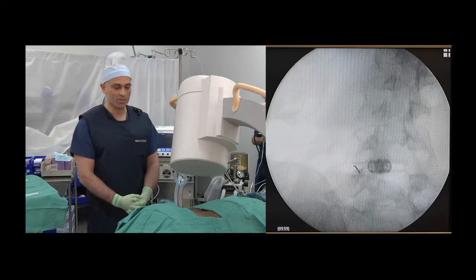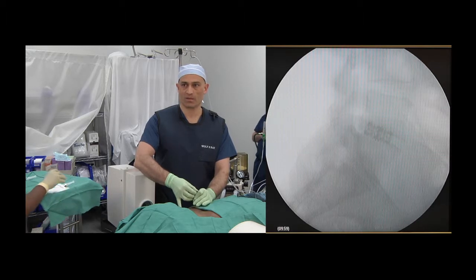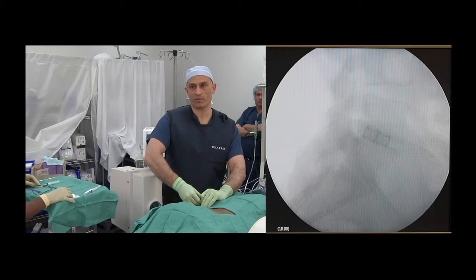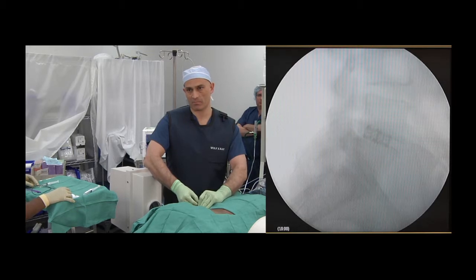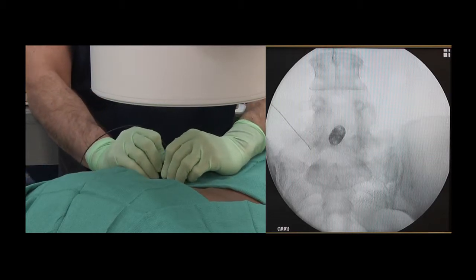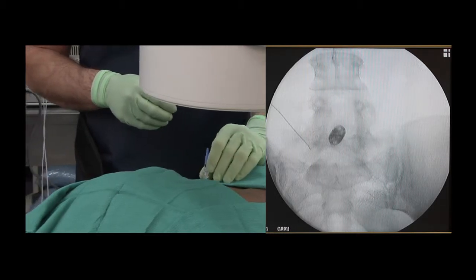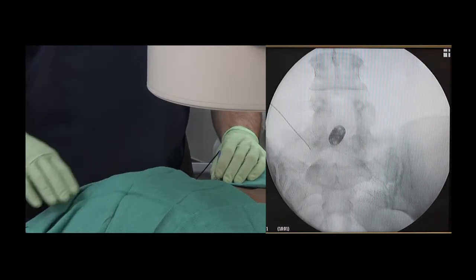The C-arm is rotated into a lateral view, which will allow positioning of the needle in the neuroforaminal space. The lateral view allows placement of the needle within the neuroforaminal space. A stimulating probe is advanced through the needle and is connected to the electrical generating device. Both motor and sensory testing will occur to evaluate the position of the needle tip within the neuroforaminal space.